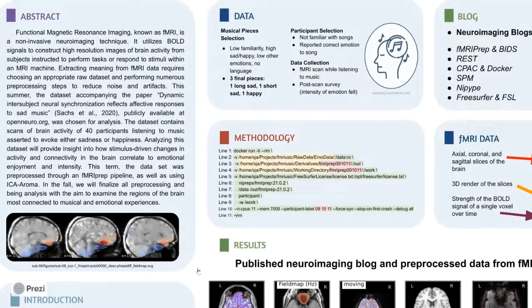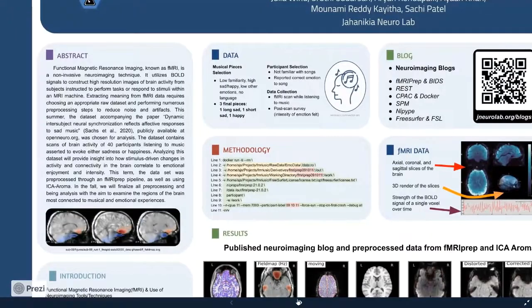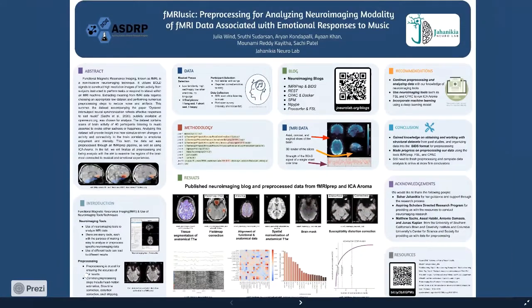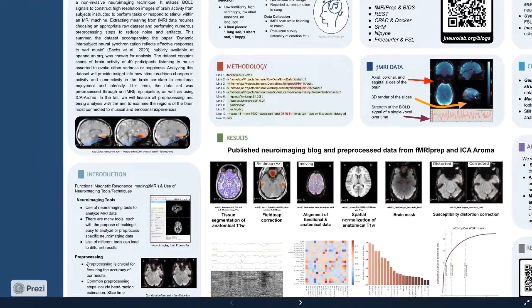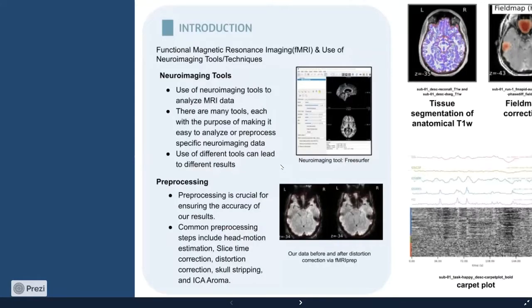So as mentioned before, functional magnetic resonance imaging is a readily available, non-invasive neuroimaging technique used to measure brain activity. Different signals and pulses produced within the magnetic field of an MRI machine are employed to observe relative activity in brain areas from sensory-related tasks or stimuli. Of these signals, an MR signal is employed to indirectly detect levels of activity in specified brain regions using the blood oxygen level dependent, or BOLD, response.